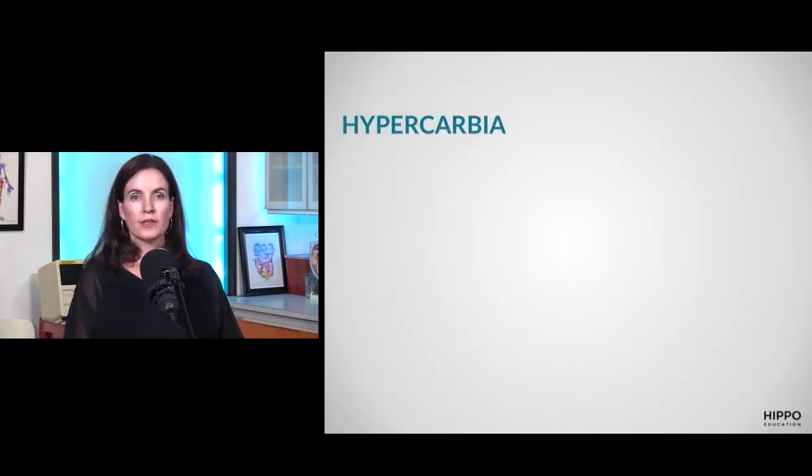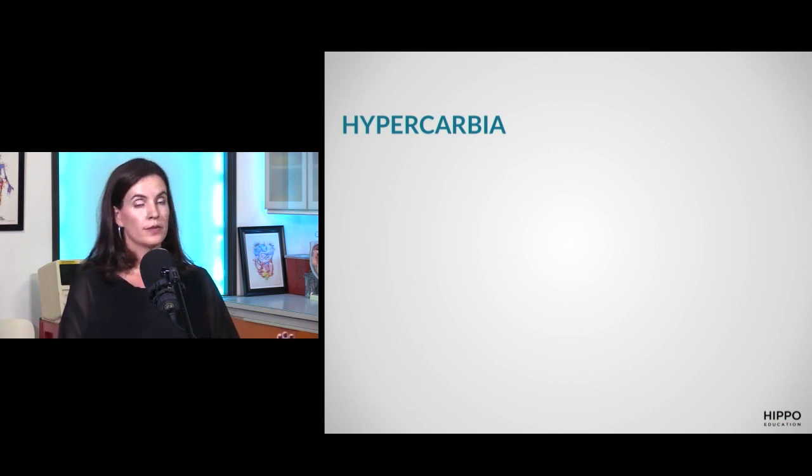Okay. So the second common problem we see in emerge patients is they are hypercarbic. Their PCO2 is too high. And so we have a couple of moves on the ventilator for fixing this. Guys, do you have ideas of what we can change on the ventilator when the PCO2 is too high? You have to blow it off. Yeah. So how can you increase them blowing it off?